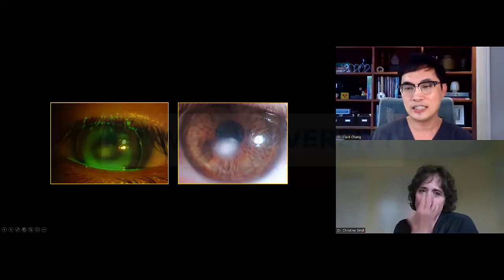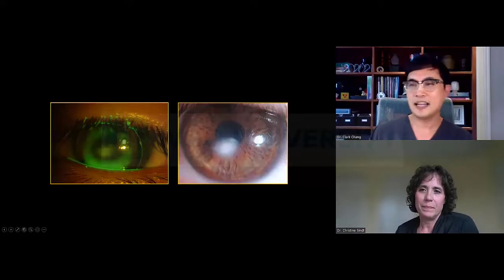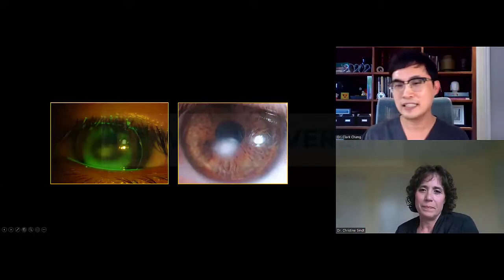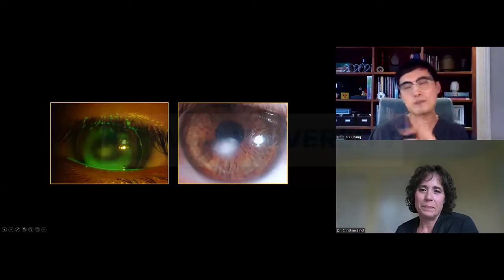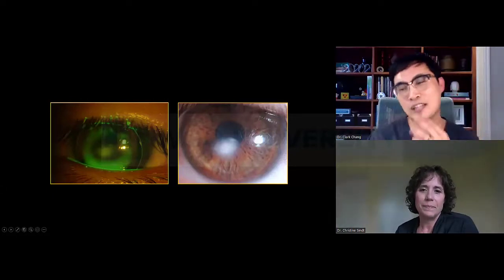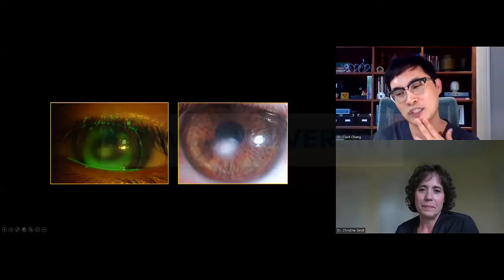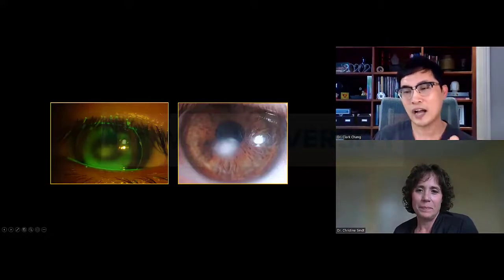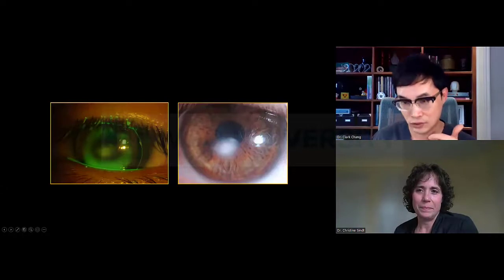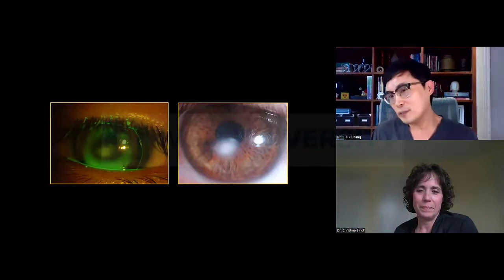But yet you could see, number one, that coloration made me feel really odd that that's a scar right there. It's not as fibrous, or fibroblastic type of change, that I usually think a corneal scar looks like. And it looks rather creamy in the center to me. So I purposely looked at that area under a higher magnification and saw these very active neovascularization. So I didn't think it was a corneal scar.